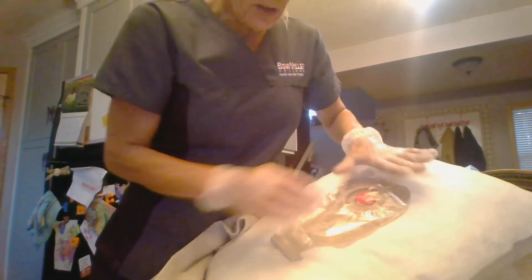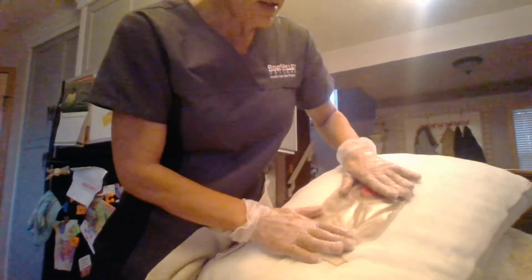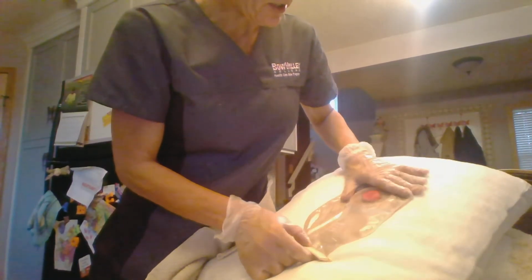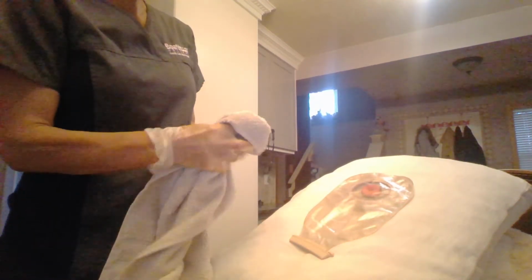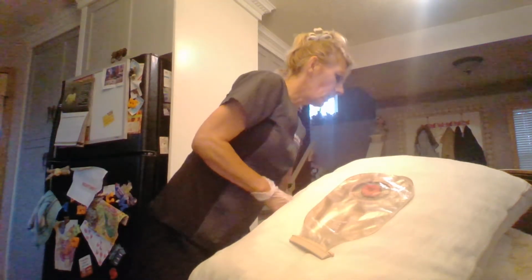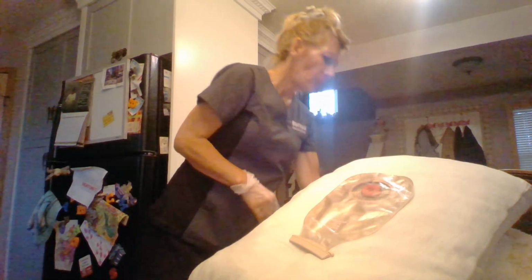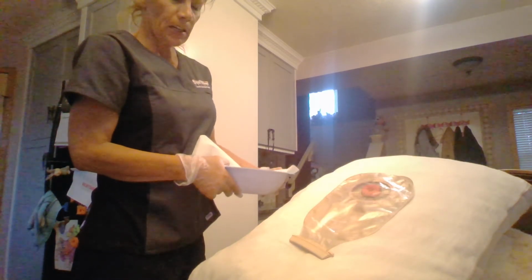unless it's in the care plan. It's cleaned with just warm water and soft gauze. Make sure it's all patted dry. Clean your supplies up. Dispose of your pan with your pouch in it in the appropriate place.